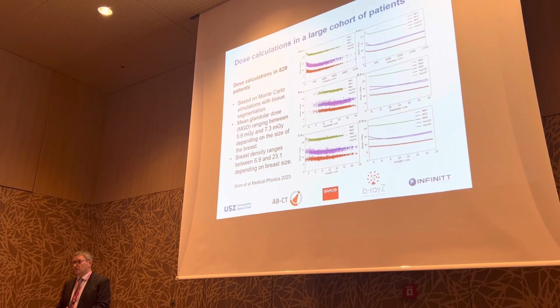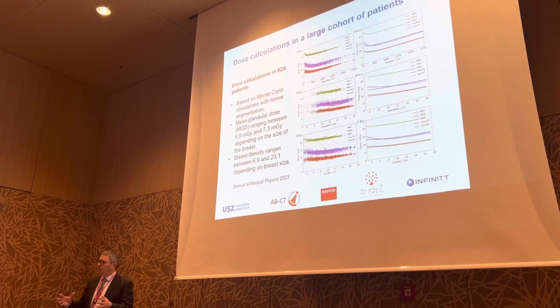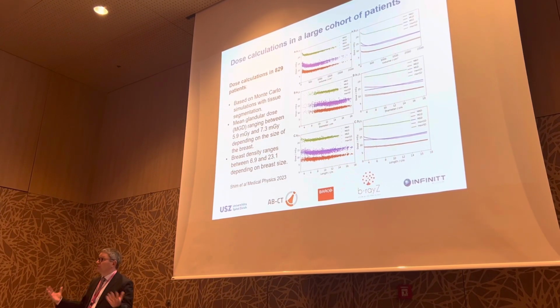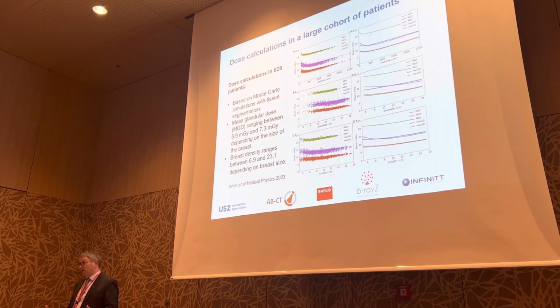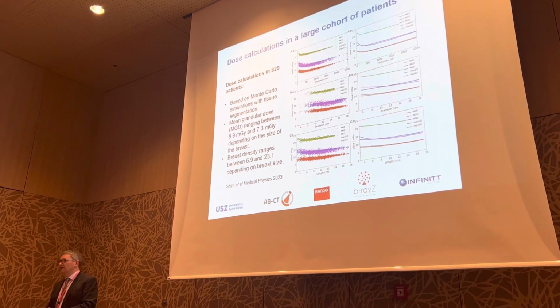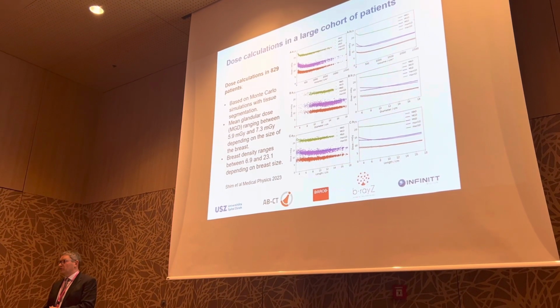differs very much from what you hear from tomosynthesis or mammography. The breast density, very often you hear that it's on average in the order of 50%. That is by far not true. That's wrong. A wrong assumption in the community, and it results in wrong dose values of the mammography devices.